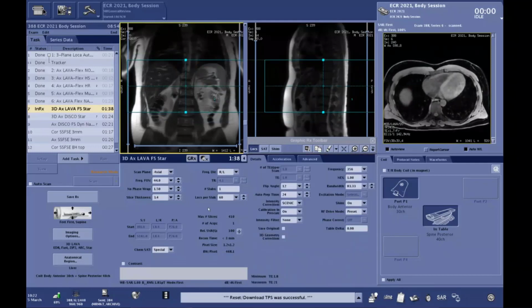And using that, it means that our patient will be fully free breathing, and we will use a 1.2 by 1.2 in-plane resolution with 3.4 millimeter slice thickness. So here again, your difficult breather and breath holder are really available to high in-plane resolution.